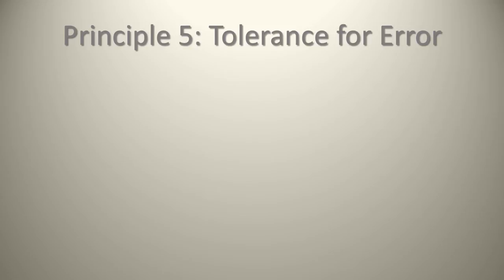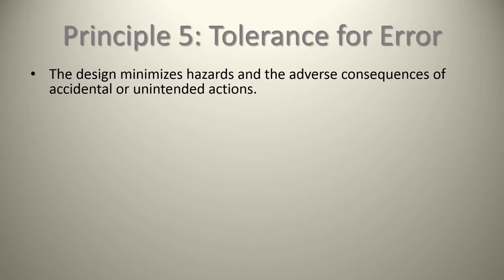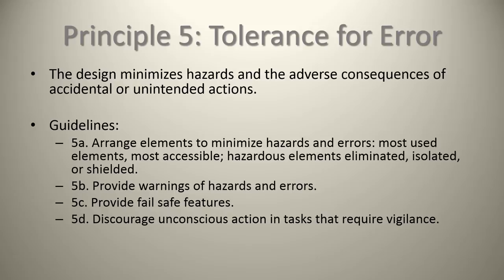Principle number five, a tolerance for error. The design minimizes hazards and the adverse consequences of accidental or unintended actions. In this respect, we talked about passive fit with screw retained versus cemented prostheses. So, arranging elements to minimize hazards and errors: most used elements most accessible, hazardous elements eliminated, isolated, or shielded, providing warnings of hazards and errors, providing fail-safe features, and discouraging unconscious actions in tasks that require vigilance. More or less, you're asking for tips, tricks and techniques that are going to give you a little bit of forgiveness if you're not doing things as per guidelines.